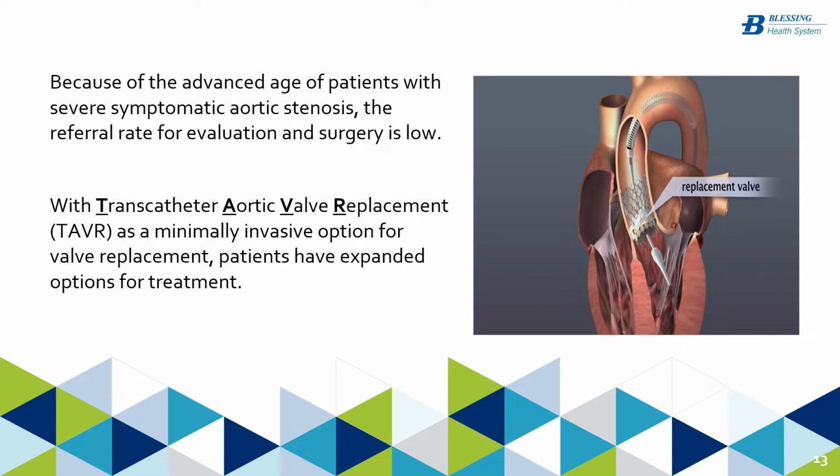It's a transcatheter aortic valve replacement. It is meant to be performed minimally invasively through the femoral artery. The TAVR valve goes inside the old valve, so there is no valve removal. There's no surgical removal of the old valve. This just goes inside the old valve and smushes it out of the way and starts working.